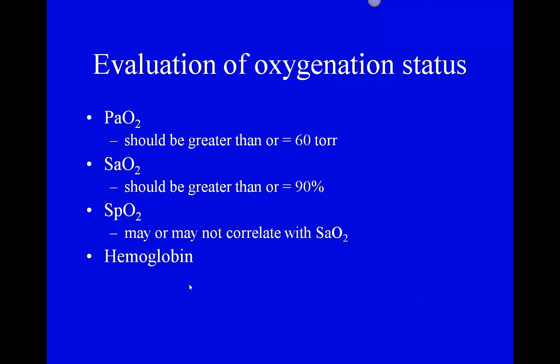We're also important when we're evaluating oxygen to know how much hemoglobin the patient has. If you remembered anatomy and physiology, high school biology, we talked about this when we talked about the role of red blood cells in the body in lecture 2 of this class. We said that red blood cells carry oxygen, and as they do that, it's important to remember they carry that on hemoglobin. So when we evaluate oxygenation, it would be important for you to remember to check the patient's hemoglobin level. Make sure they have adequate hemoglobin.